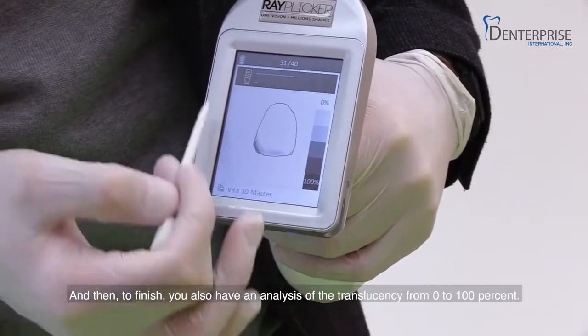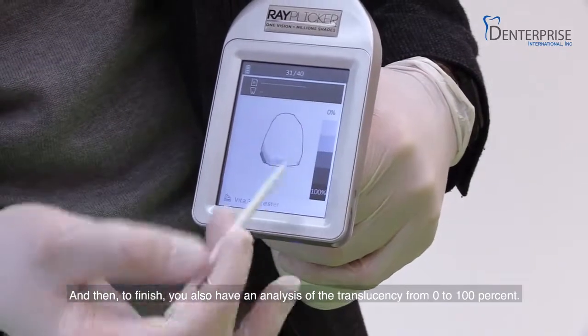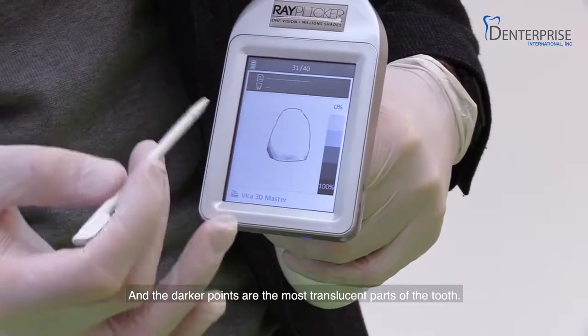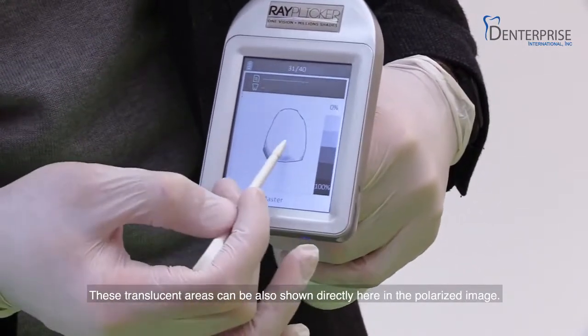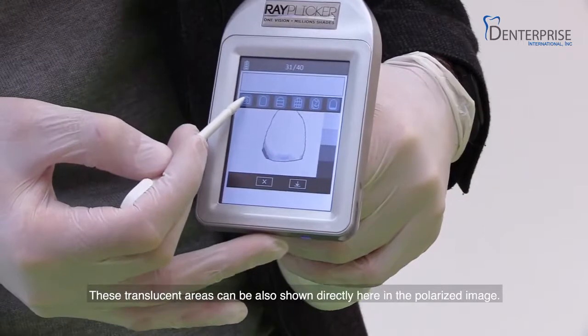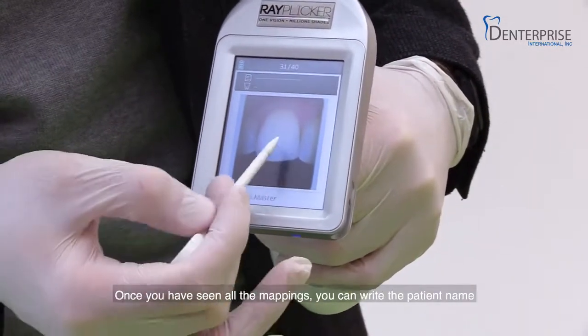And then to finish, you also have an analysis of the translucency from 0 to 100%, and the darker points are the most translucent parts of the tooth. These translucent areas can also be shown directly here in the polarized image.